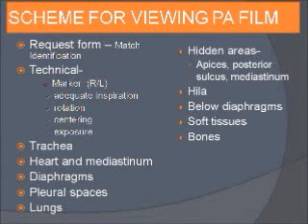Now coming to how we should read a chest X-ray. There are many ways, and different people follow different ways of reading a chest X-ray, but everybody should develop a technique or a pattern so that he may not miss anything and all areas may be covered.